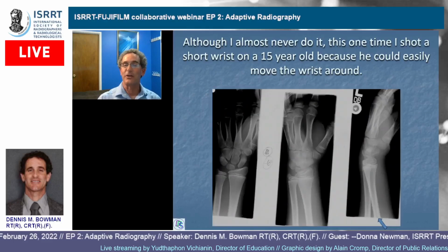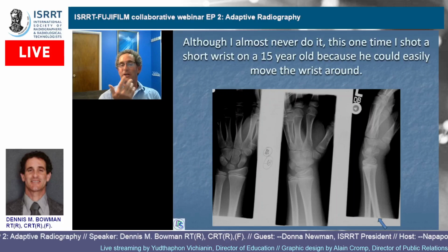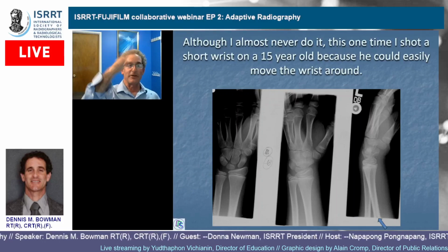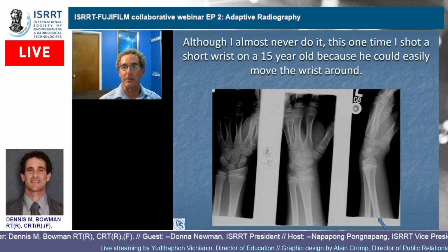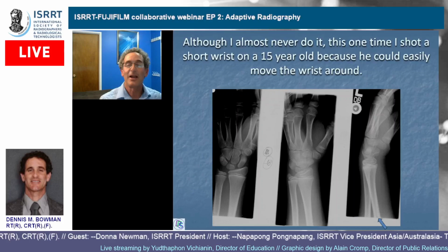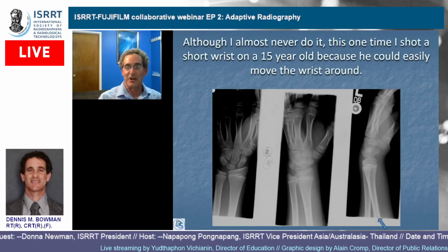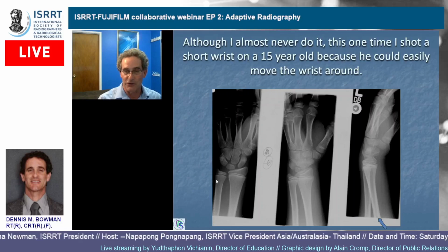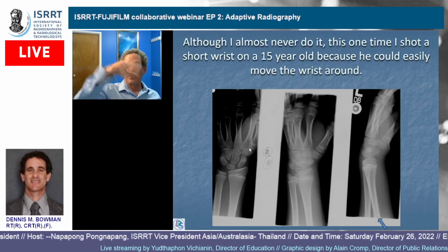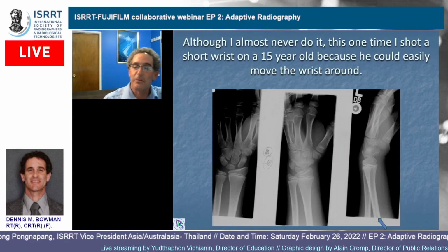So I had this kid, he was 15 years old, and he was skateboarding, fell down, comes in, and the doctor orders a wrist, but the kid's like, okay, well, what do you want me to do? And I'm like, well, whatever I do, it doesn't really matter because you don't have a fractured wrist. Even though, again, there's no such thing as a fracture of the wrist. No radiologist is going to read out fracture of the wrist. It's going to be a fracture of one of these bones in this area, and this whole area is called a wrist. But whatever. The kid was moving his hand all over the place, and there's no fracture there, but whatever.